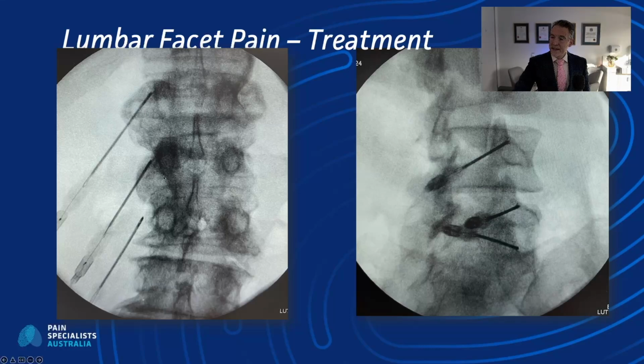You can certainly see that pedicle, which is quite dark and difficult to discern, quite dark and black and fluffy compared to the other side. So perhaps that facet joint is the cause of pain. Now remember, if I wanted to anesthetize that facet joint, which is possibly the L2-3 facet joint, I need to anesthetize the medial branch above that and the medial branch at that level. And similarly for the facet joint below that. So that's just the minutiae, the nomenclature of what we're talking about, but effectively it's quite a technical treatment.